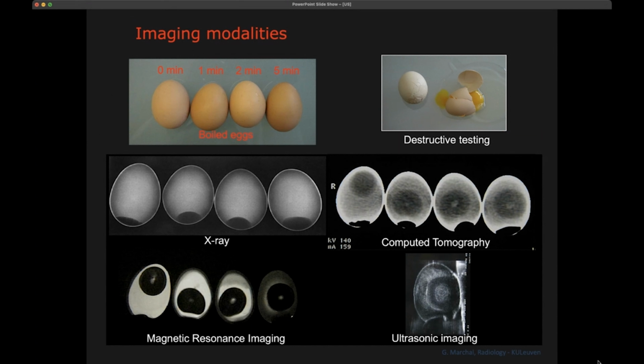there's not a single imaging modality which is ideal, in such a way that we would only need that. So each of them is using a different principle. So it's looking at different measurements of some physical properties of the object or the organ or the body that we try to image. And by the fact that they have different working principles, they look at different properties of the object. And so these properties are, of course, then clearly visible in the image. And as I said before, what is important to always keep in mind is that you measure a physical property and that you then try to relate this to what you want clinically, namely looking at anatomy or function or blood flow or something like that.